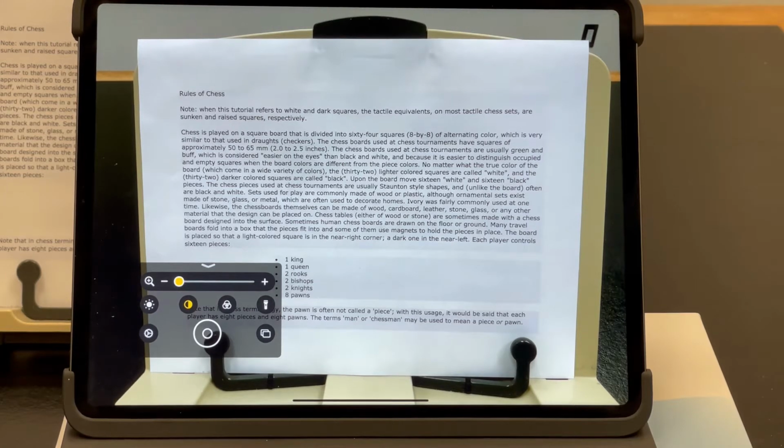A key point is that most clients will be holding their device in their hands. Mine is on a stand, and so is my reading material. When hand holding the device and/or the reading material, magnifying will also magnify any small movements of the device or the reading material, resulting in a shaky view. We'll look at a way to counter this in a moment.